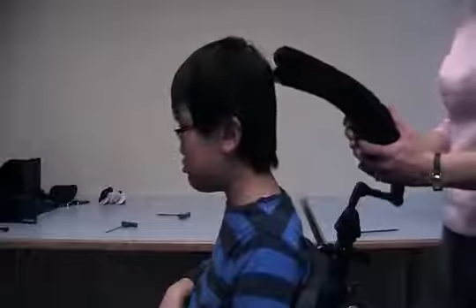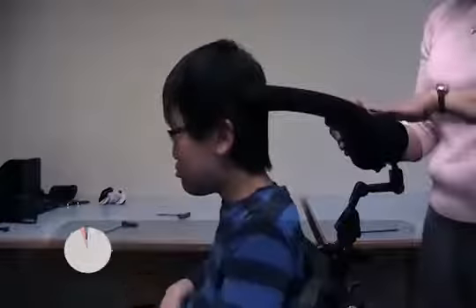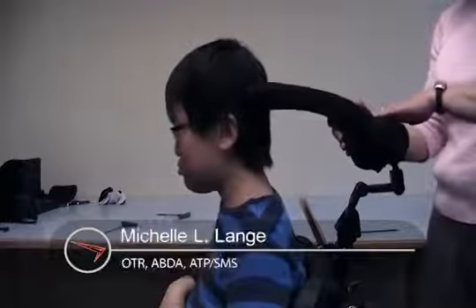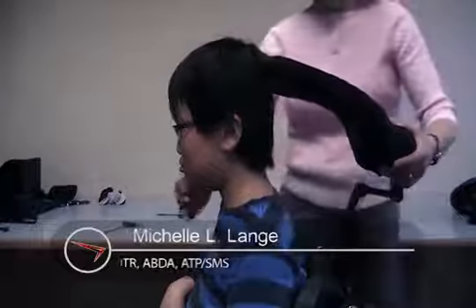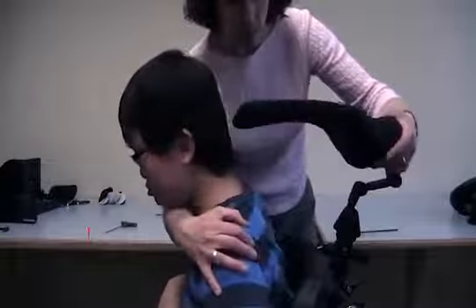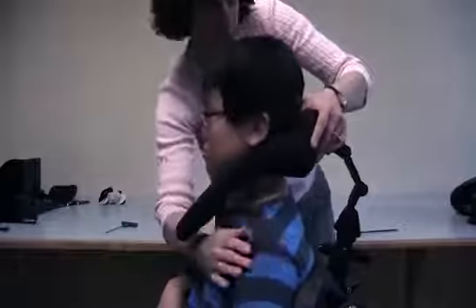The eye-to-eye headrest primarily consists of a suboccipital support area. A good way to begin fitting this is to move the client forward slightly and then back into the head support.